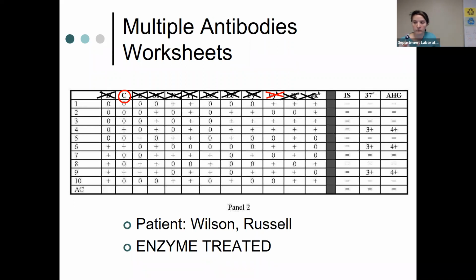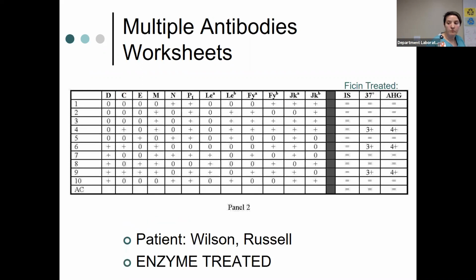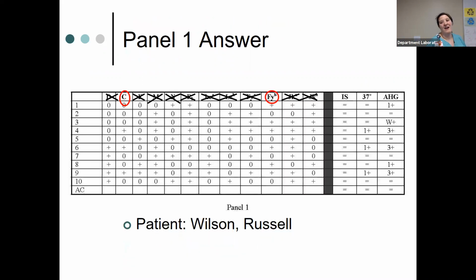So for the previous panel, would you need to do ficin treatment, or could you just say that he... In this example, I don't really feel like ficin is necessarily needed.